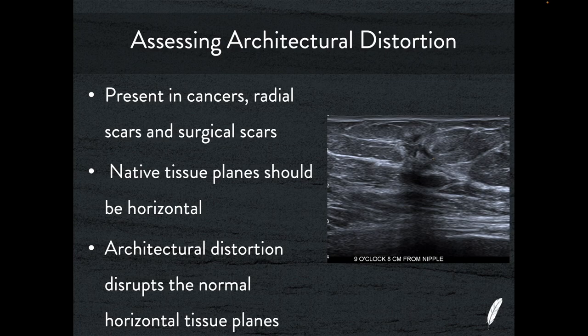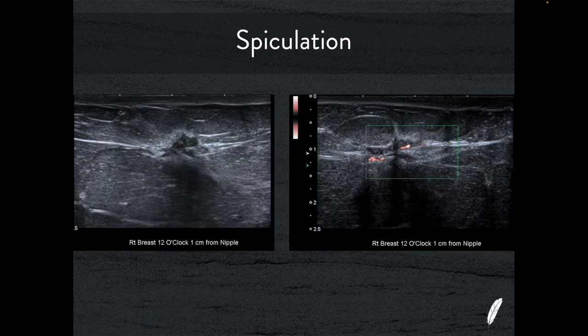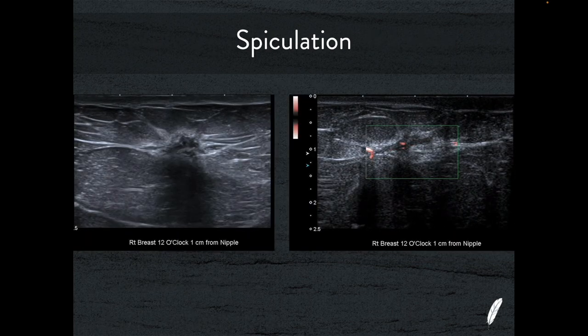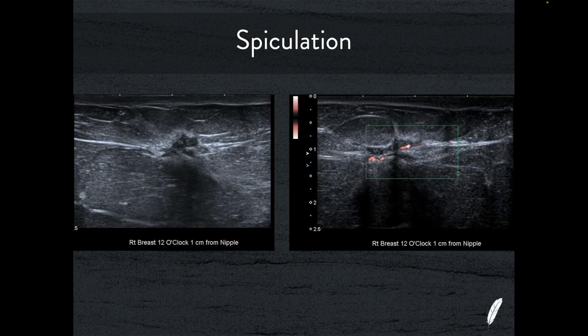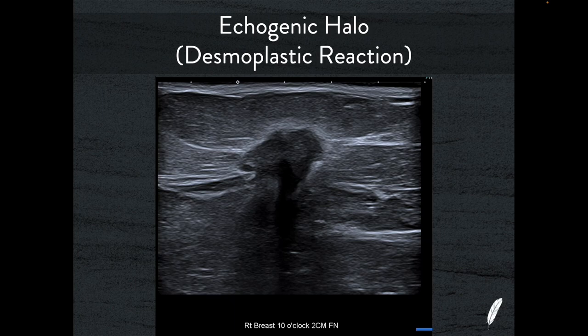Assessing for architectural distortion: we'll see it in breast cancers, in radial scars, and in post-operative breasts. You can see here the natural horizontal lines through the breast have become disrupted — the breast cancer has grown up through them, really distorting the natural architecture. This is an example of spiculation — the breast cancer is spreading in a star-like fashion, invading the tissues radially in all directions around itself. With SMI there's a lot of flow in the central nidus. This is an echogenic halo — a desmoplastic reaction — you can see around the edge of this breast cancer this echogenic rim, with a lot of tethering of tissue and disruption of the normal architecture. This is really typical of a breast cancer.